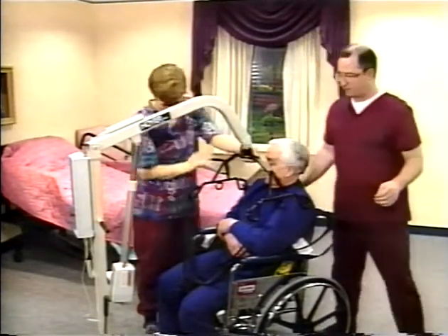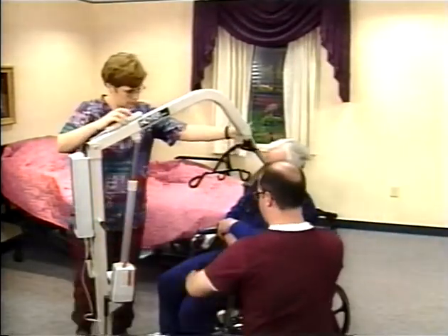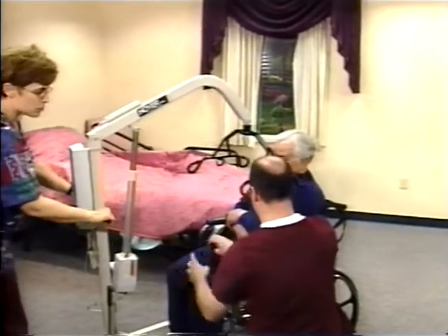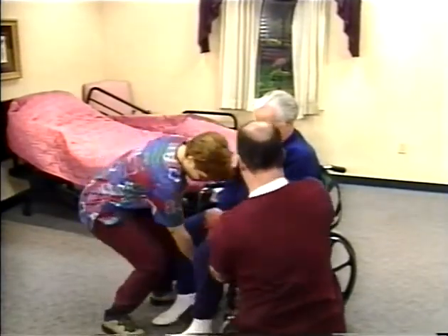Removing the sling is optional, depending on your passenger's needs. If another move is imminent in the near future, you may decide to leave the sling in place. If your resident asks you to remove it, however, be careful. Pulling on the sling could cause him to fall forward.